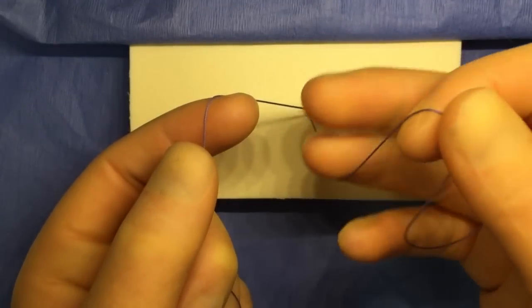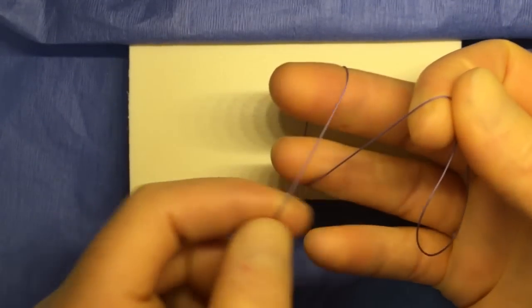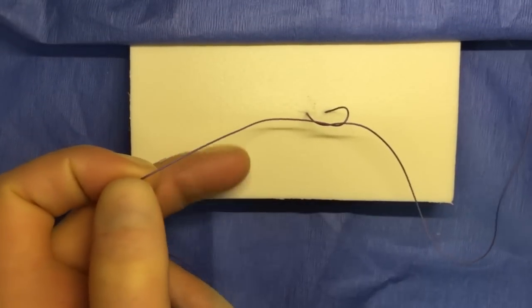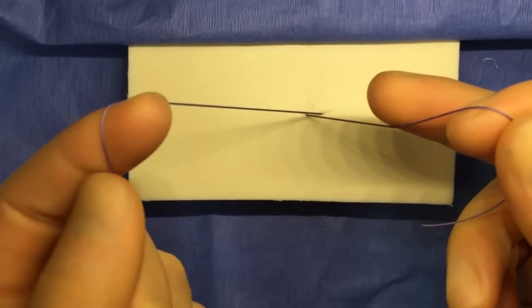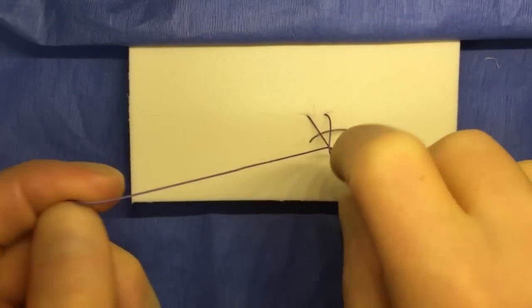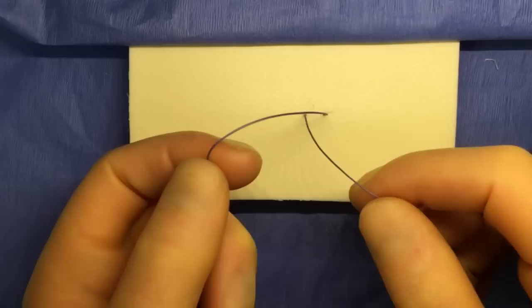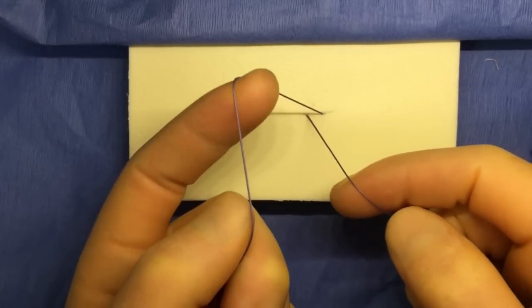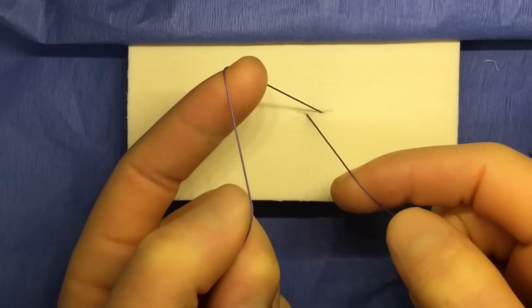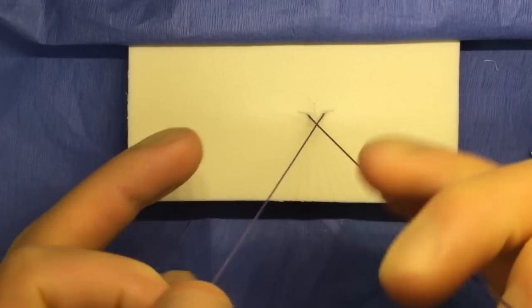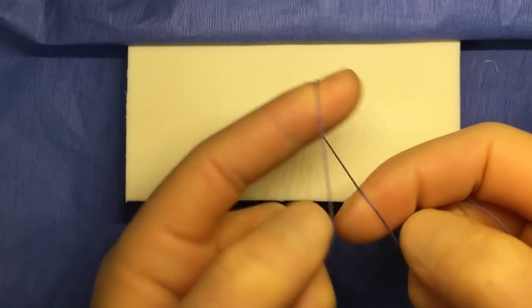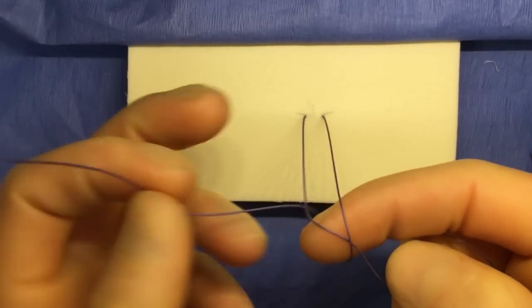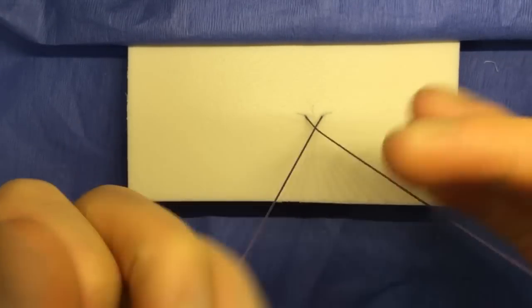The knot is comprised of a backhand right-handed one-handed knot, and you can use two fingers to do that. Alternatively, you can backhand a one-fingered right-handed knot. At the same time, you will throw a forehand left-handed one-handed knot. Again, you should have practiced both left and right-handed one-handed knots for this. The forehand motion is the typical crossover and pull through with the left hand.